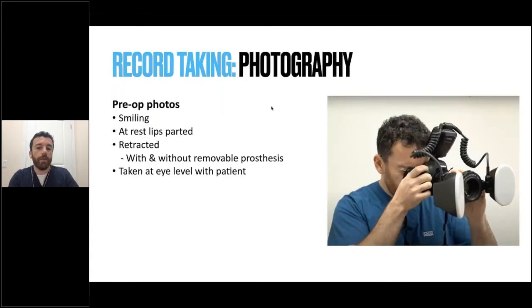For photography, that's a whole separate topic on its own. I'd highly recommend taking a photography course if you're serious about things, but basically you're going to want to have smiling photos, at rest, lips parted, retracted, with and without the prosthesis in place. And these are taken at eye level with your patient.